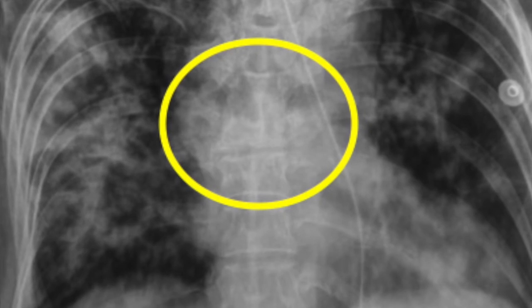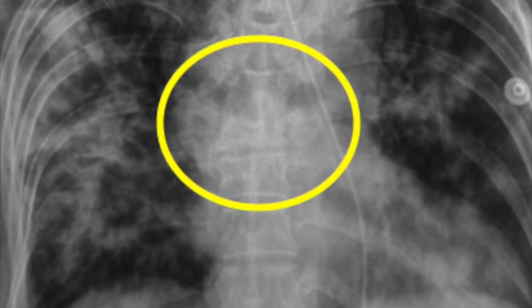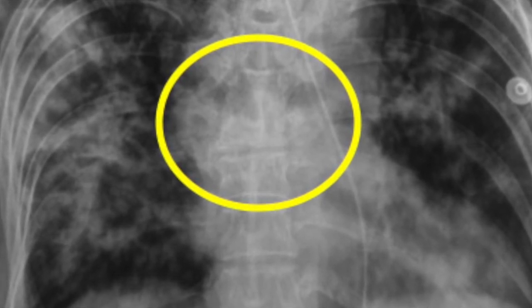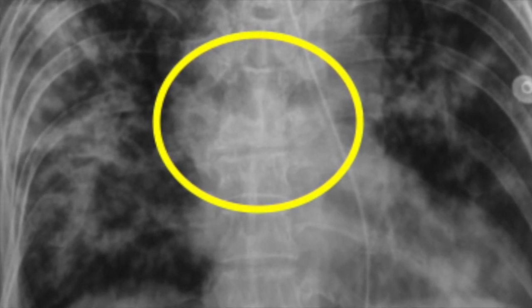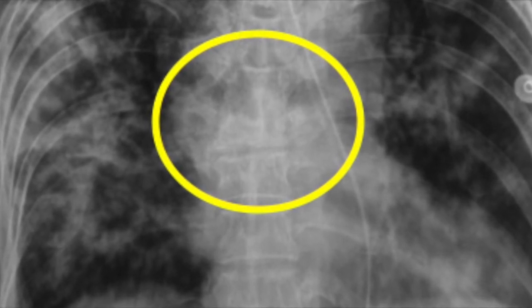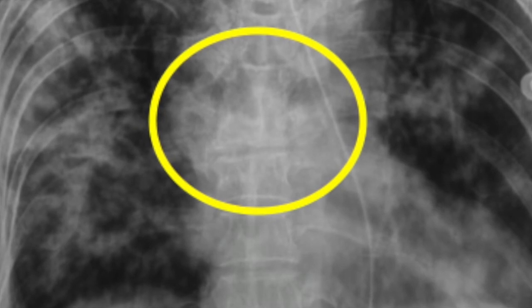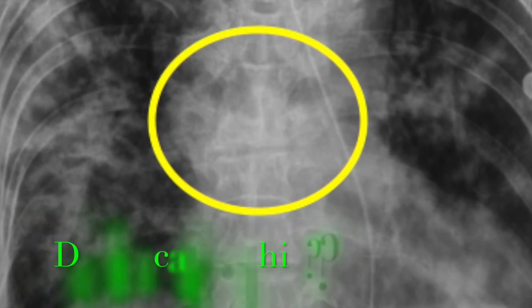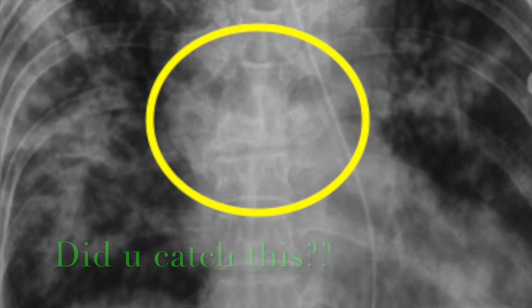In summary, any time you see a chest X-ray with large consolidations and breakdown, look for other signs of tuberculosis — it could be in the form of a pleural effusion, rib destruction with a soft tissue lesion alongside it, or, not uncommonly, spinal tuberculosis as we found here in the form of a collapsed vertebral body.